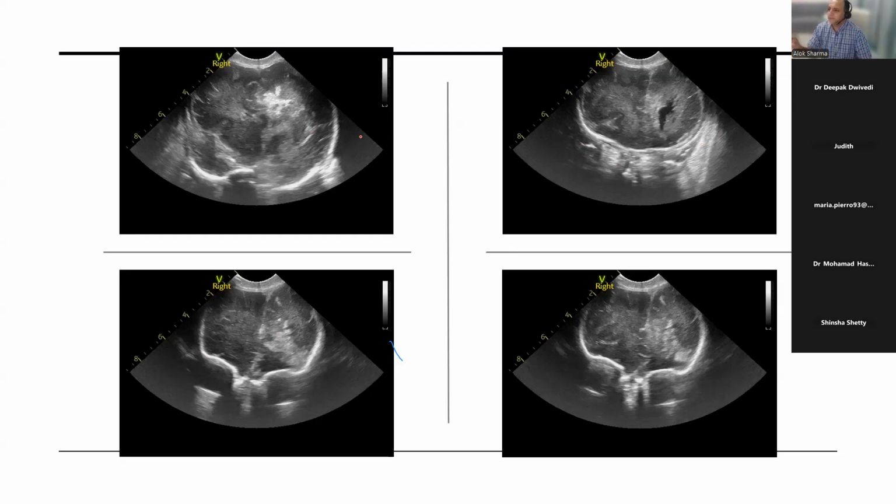Okay. What else? On the left side there's a hyperintensity. Yeah. So we talked about meninges. We talked about sulcal gyral differentiation pattern. What about the frontal horns? I should normally see frontal horns over here. Am I seeing frontal horns? No. Okay, so I'm not seeing a frontal horn on the right side. I've got sulcal gyral effacement. I can barely see sylvian fissures in the midline. Again, hardly any sulci. So what am I thinking? There's no interhemispheric fissure either. Yep, very good. So what are we thinking? Maybe cerebral edema. Okay, so we see cerebral edema. Now, is this the frontal horn?